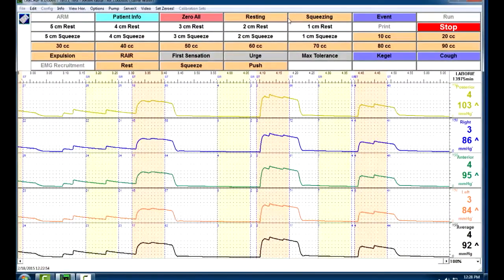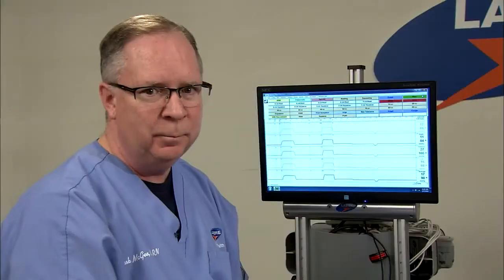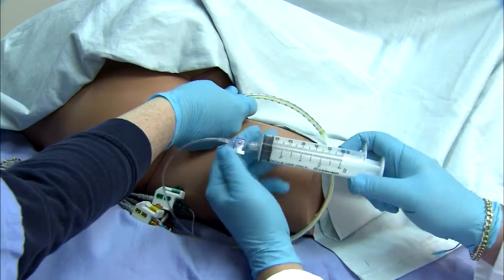Because now what we're going to do is advance the catheter back into the rectum, and we're going to do the RAIR test. RAIR stands for rectoanal inhibitory reflex. We will be using the same catheter. Attach a 60cc syringe to the stopcock.